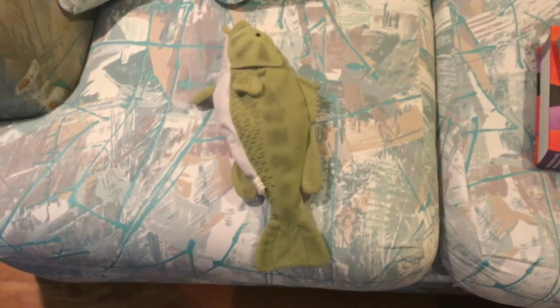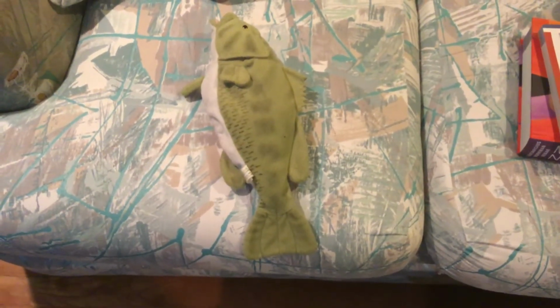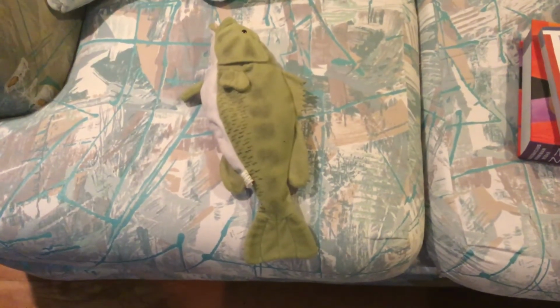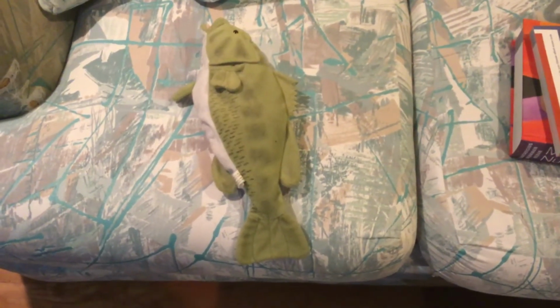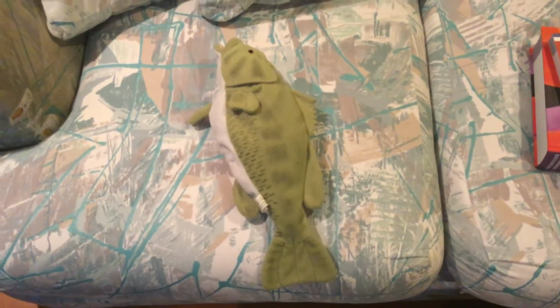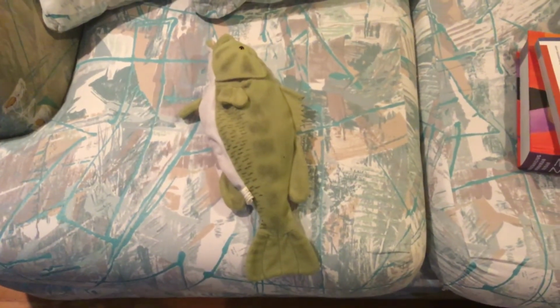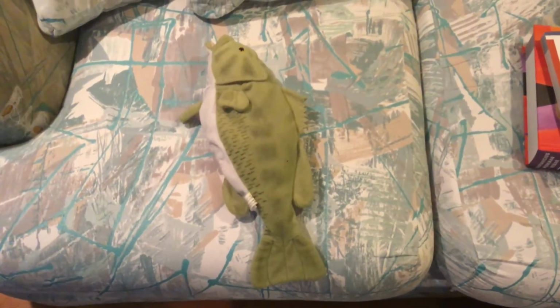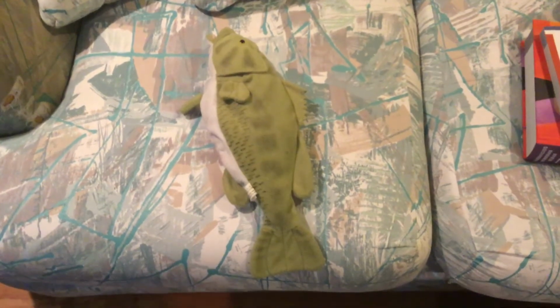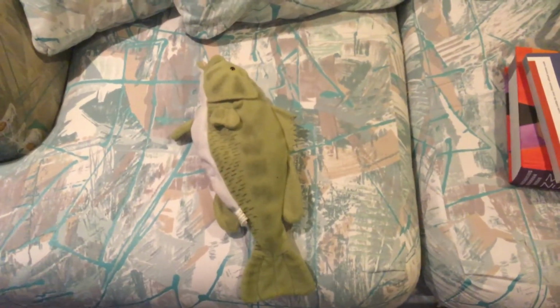Gather my equipment, and that would be gloves, tongue depressor, blue pad, irrigation syringe, irrigation bottle with tap water, source of water for dissolving medications, pill crusher, and stethoscope. Deliver supplies to patient's room. Identify myself and purpose for the delivery when placing items on bedside table.